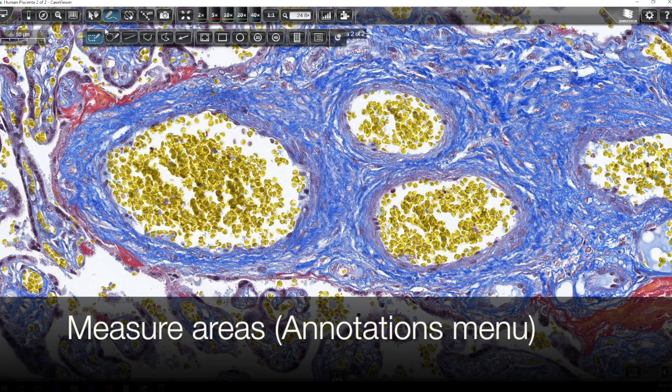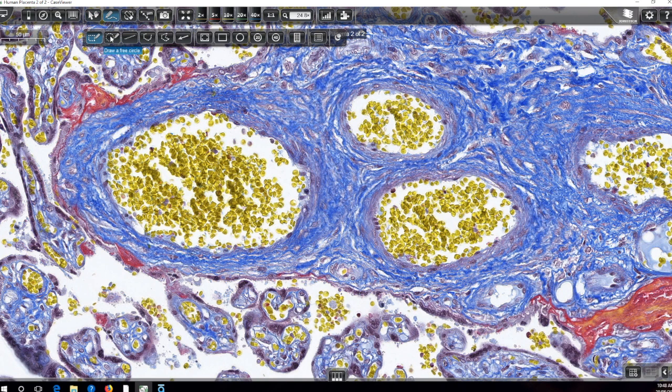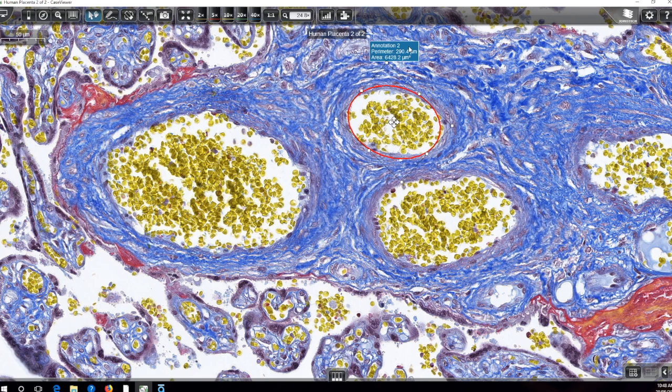Now there's an alternative way to generate measurements using this software from the annotations menu. So you see we've got a series of shaped icons. One way if you're just looking to get an approximate measurement is you can select this circle or oval tool and then by right clicking we can make some minor adjustments so that it fits a little bit better. So we see there we've got an approximate area of about 6428 square microns.